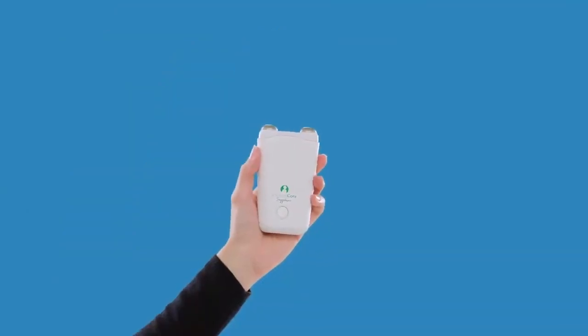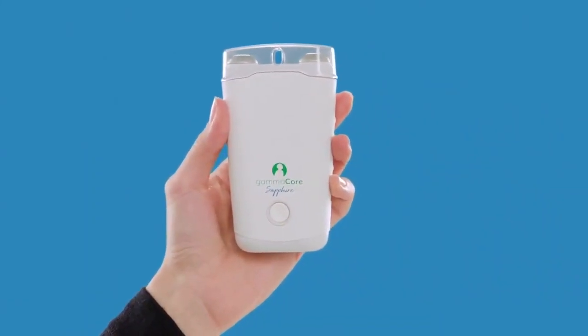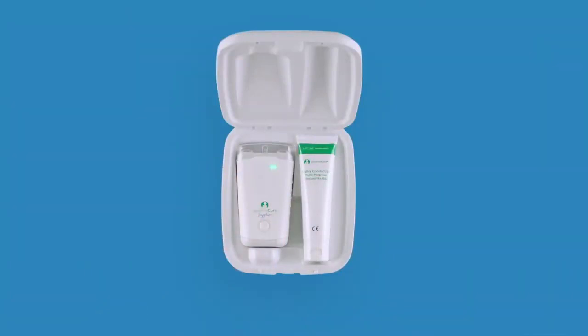When finished treating yourself, make sure the device is clean and put the cap on the stimulation surfaces to protect them. If your device is low on battery, place the device with the power button facing up into the charging station. The device will show CH with the battery charge indicator bars flashing. Only use the provided power adapter with the charging station.